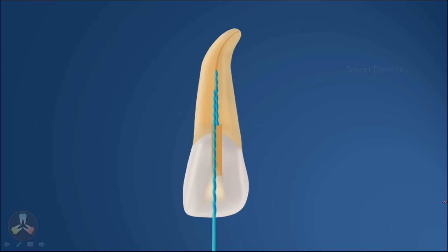If we could go till the full length of the fractured file, you can just enlarge the canal and then you can irrigate, and you can do the same procedure little by little, and surely if you can go till the tip of the fractured segment, then we will always be able to remove the fractured file.